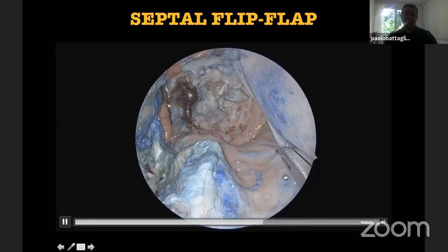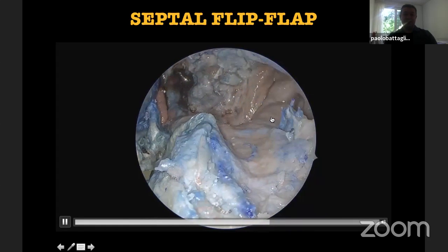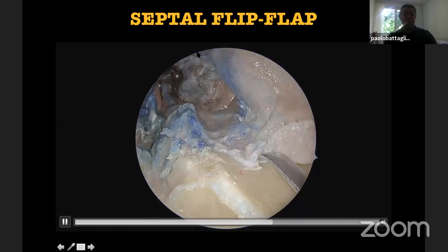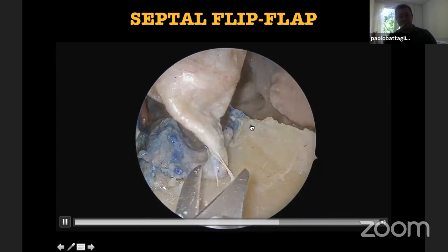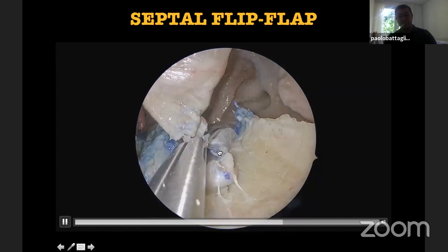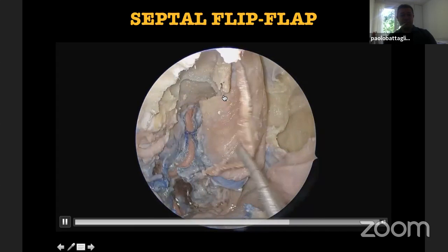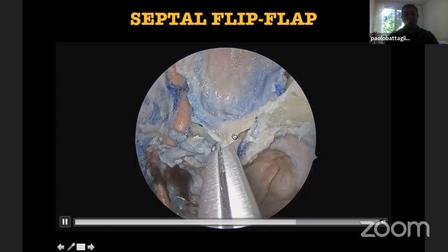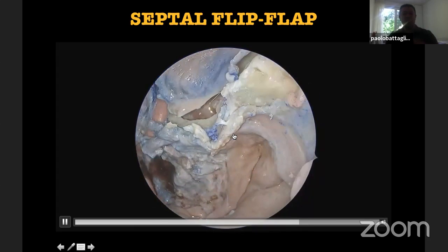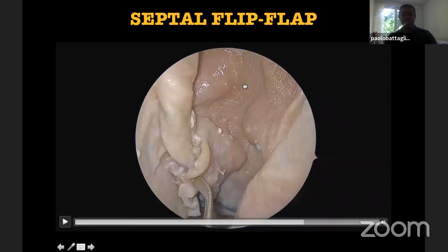Okay. Now, of course, we have to perform the posterior incision, and here is the level where the septal branch of the sphenopalatine artery runs posteriorly. So we complete the inferior incision of the flap and try to turn it. But if you don't cut here, you see the flap will stay attached to the basisphenoid. And then in such a way we can turn the flap up and cover all the defect, as you know.